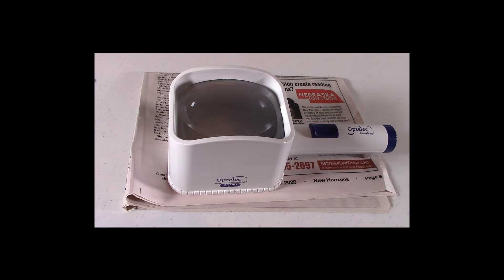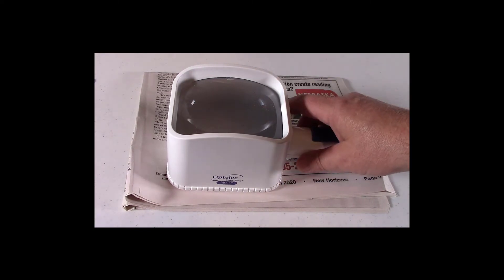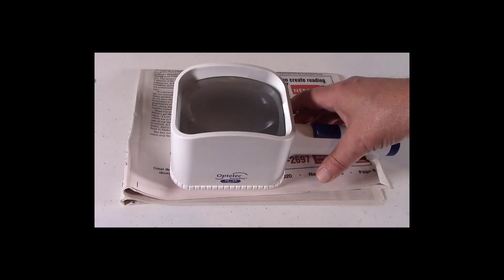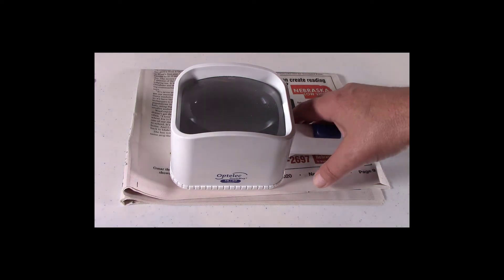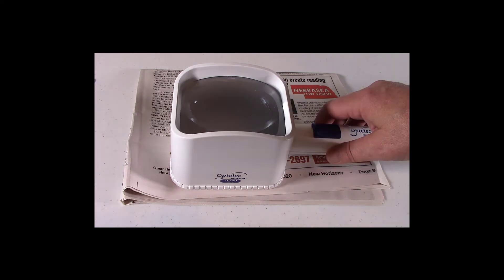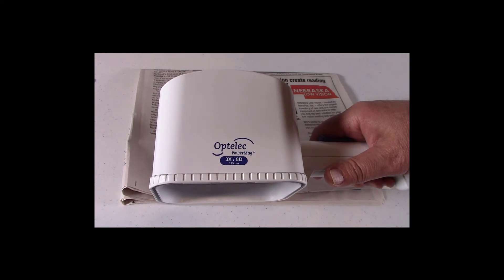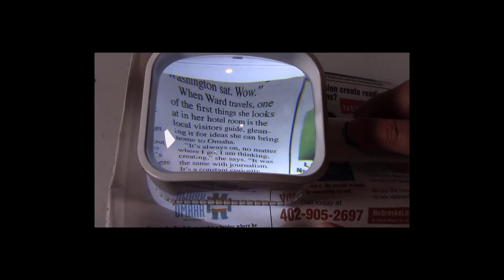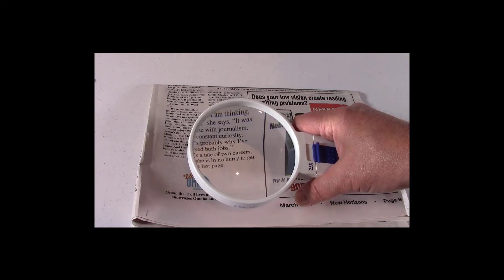The next difference is handheld versus stand magnifiers. A stand magnifier is a lens mounted to a stand which holds the magnifier at the correct height. Holding a magnifier at the correct height above what you are looking at keeps it in focus. Whatever you are looking at is in focus when you are at the proper height, called the lens focal length — the distance between the lens and what you are looking at. This is why people love using a stand magnifier, as it guarantees reading is steady and clear. A handheld magnifier has to be held at the proper height so what is under the lens is in focus.